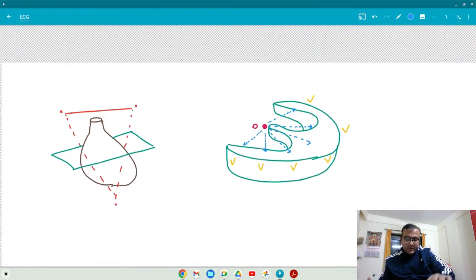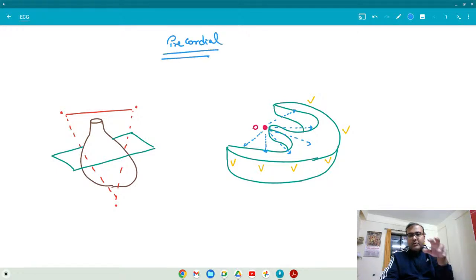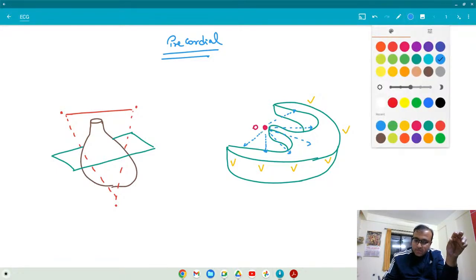Okay, so we can call it as precordial leads or chest leads. Now, usually we number it like 1, 2, 3, 4, 5, 6.